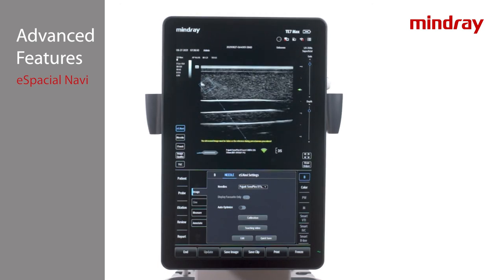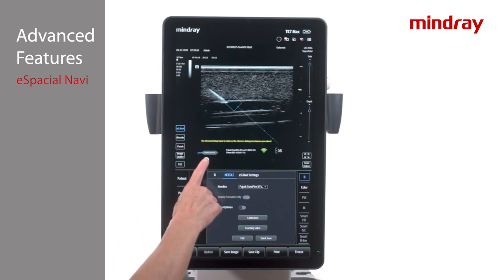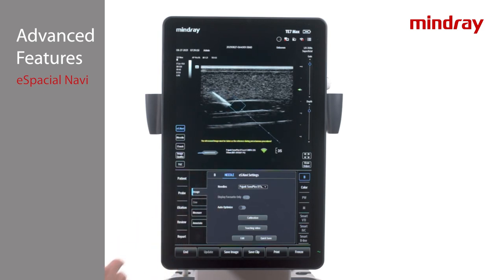For out-of-plane procedures, change the angle and degree of the needle to alter the target box location. Advance the needle toward the target. The top yellow dot is the needle tip. Orange means the needle has fallen out of the ultrasound beam. For in-plane procedures, the colors mean the same: once the box is blue, the needle is in-plane with the ultrasound beam. Notice the graphic at the bottom left of the image which shows the needle orientation in relation to the ultrasound beam.